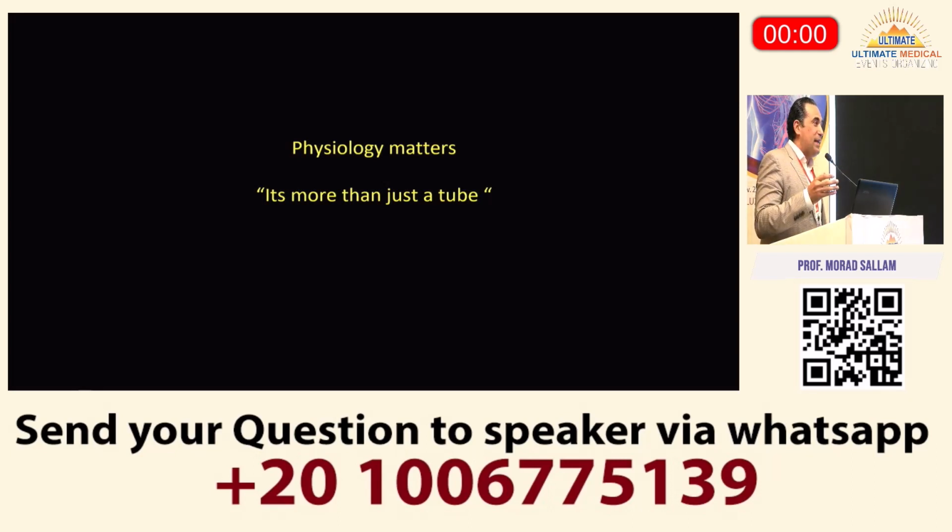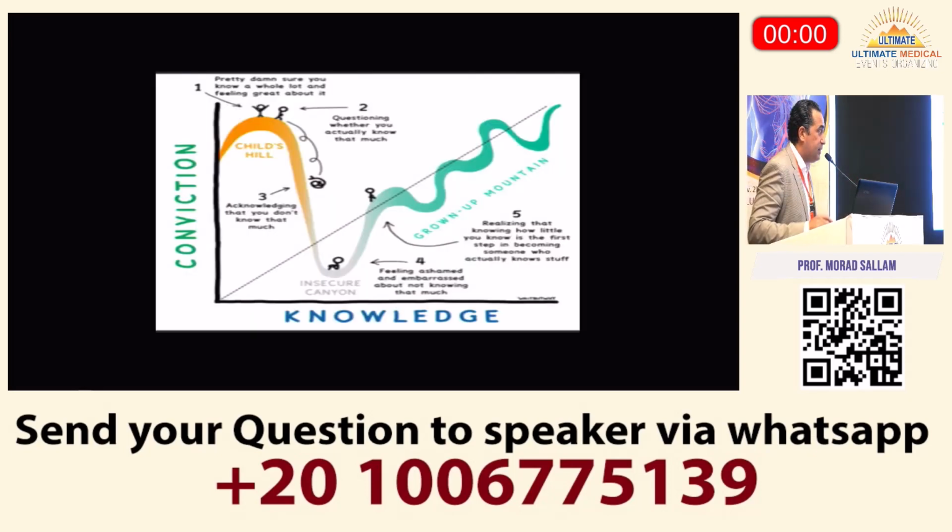So it's not really a tube that we are putting in, and we are understanding as we come closer to the heart that the current technology that we have as a tube is probably not going to work as well as it worked in the infrarenal and descending thoracic. We need something to respect the arch, not only anatomy, physiology and pulsatile flow, and a lot of evidence is coming up on that. When I started, I thought we were here. I think we have dropped down now a little bit more, knowing a bit more about thoracic disease and endovascular, and we are on the up curve of learning.